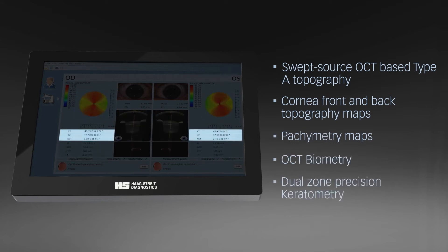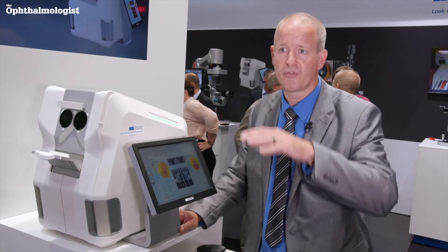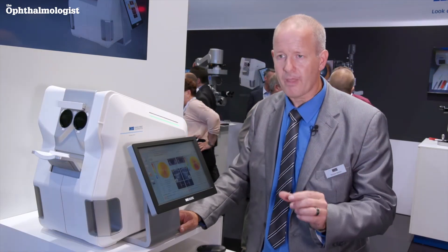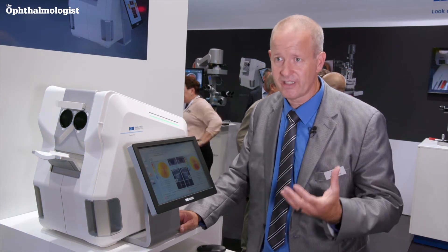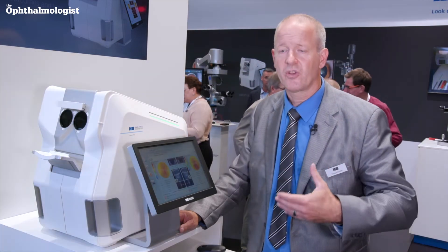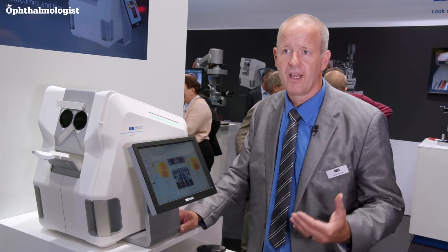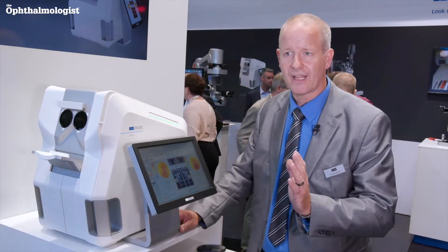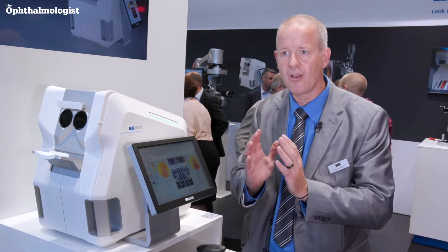It's a real topography — not only for the front but also for the back of the cornea. You have pachymetry, lens measurements, and lens tilt assessment. So if a patient is opting for a premium IOL, you can evaluate this parameter to check whether everything is okay or if the eye has an unusual setup.